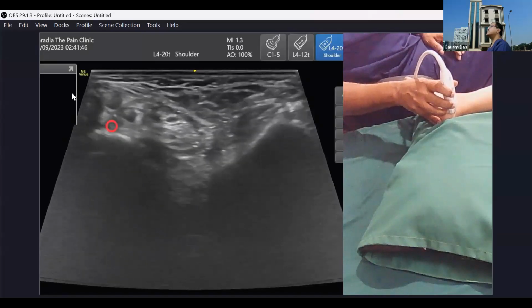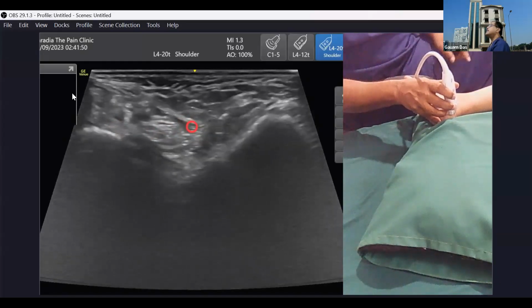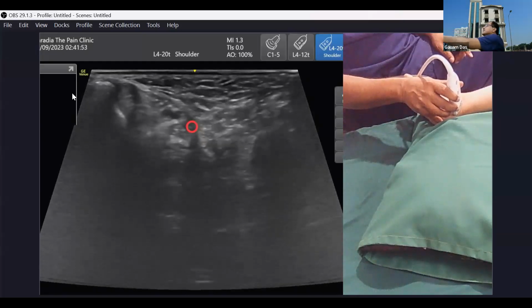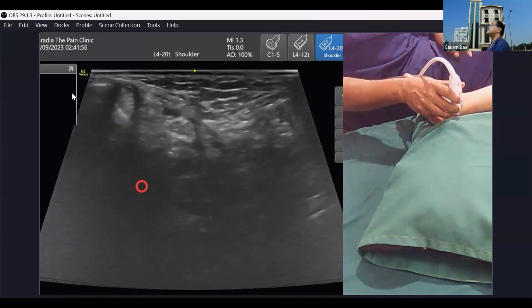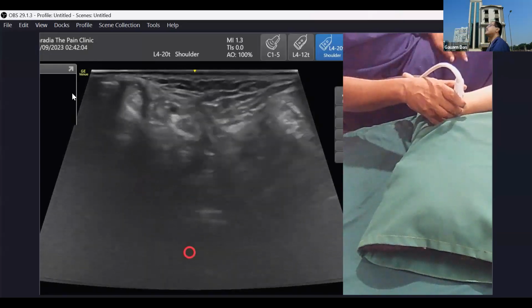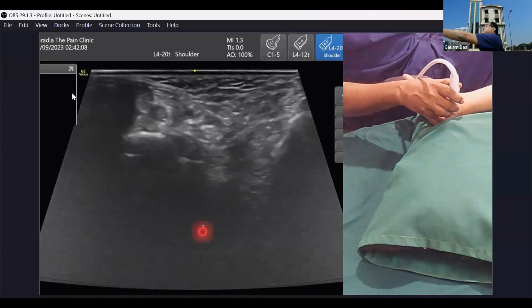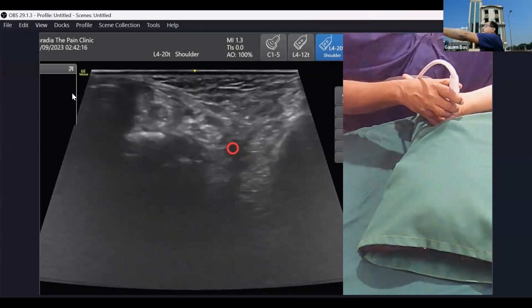Okay. So I am in the tarsal tunnel now. And this is the tibial nerve getting divided. If I'm going more above, here is your tibial nerve. Okay. So the tibial nerve, this is the blood vessel, the tibial nerve, follow that. It is getting divided. Remember the three branches initially. What were the three branches? The medial calcaneal, lateral plantar, and medial plantar.